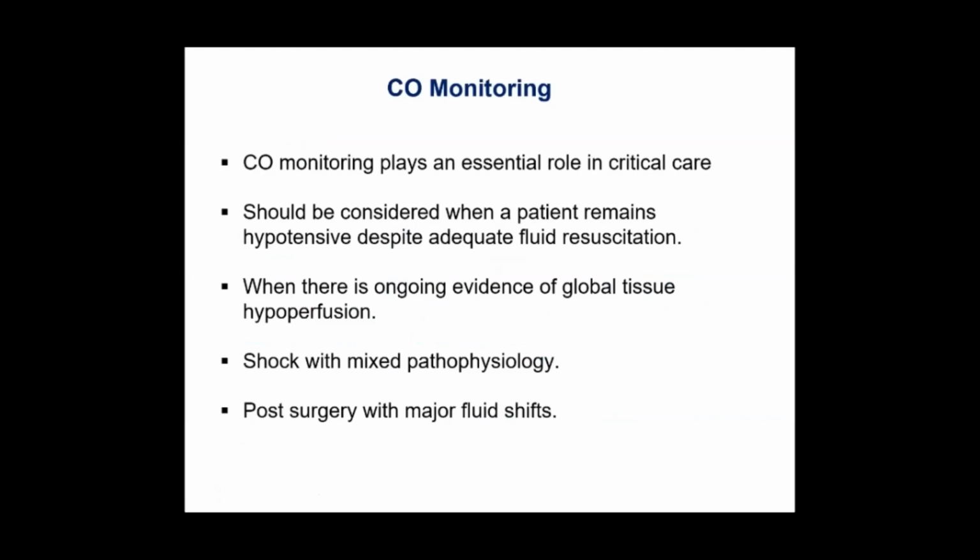So cardiac output monitoring plays an essential role in critical care. It should be considered whenever a patient remains hypotensive despite adequate fluid resuscitation, and when there is ongoing evidence of global tissue hypoperfusion, you need cardiac output monitoring. Shock with mixed pathology: what is the mixed pathophysiology?